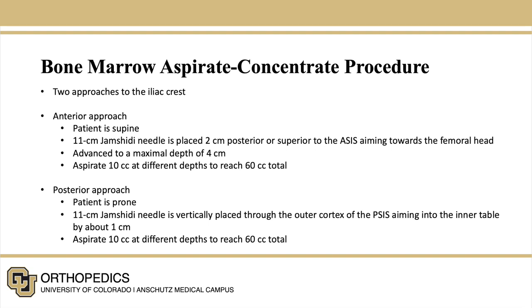In the posterior approach, the patient is prone and a Jamshidi needle is placed through the outer cortex of the PSIS. Again, 60 cc's is aspirated.